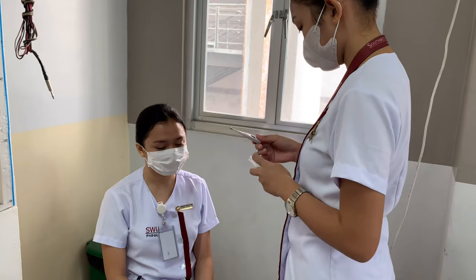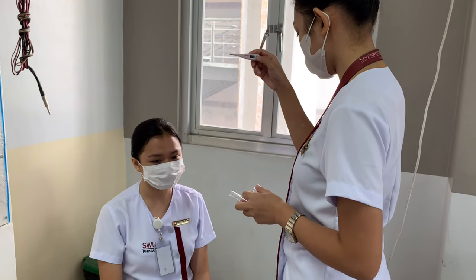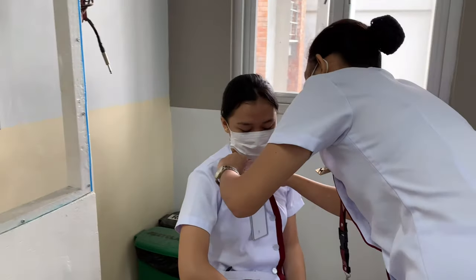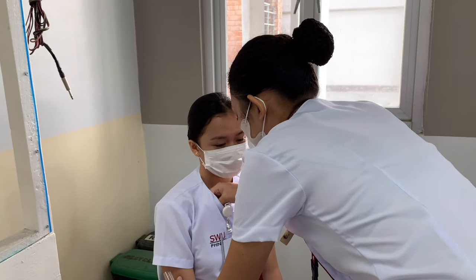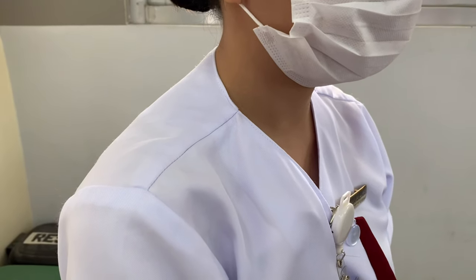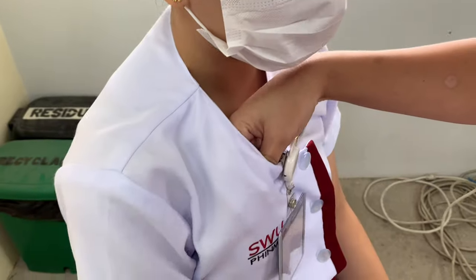In getting the body temperature, help the client to assume a position of comfort. For axillary temperature, this is to promote relaxation. Take the thermometer out of its holder, turn on the thermometer, and place it in the armpit. Placing the device in contact with the axillary blood supply can maintain the device in its proper position.